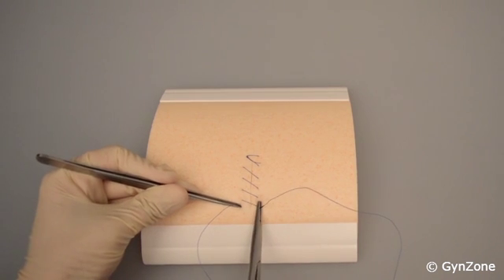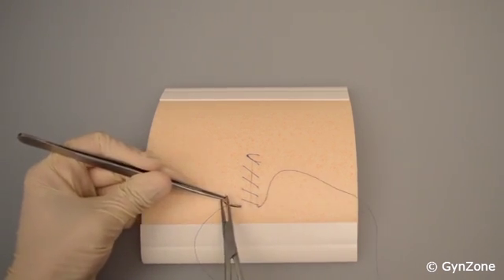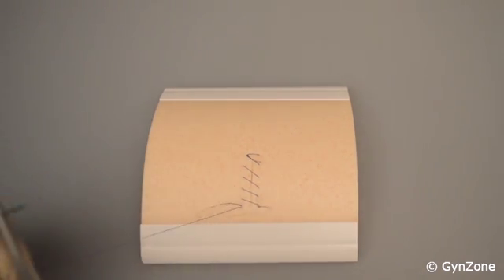Grip the needle with the dissecting forceps, release the needle holder and use it to pull the needle through while following the curvature of the needle.